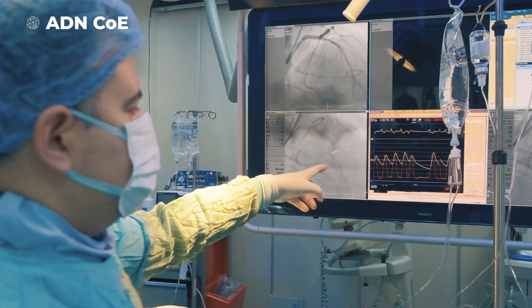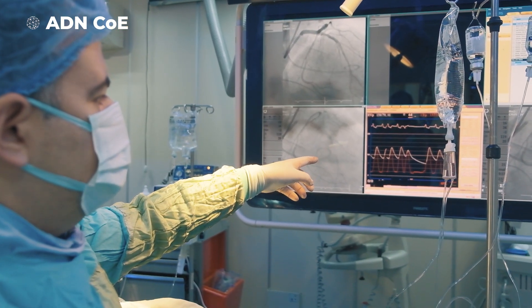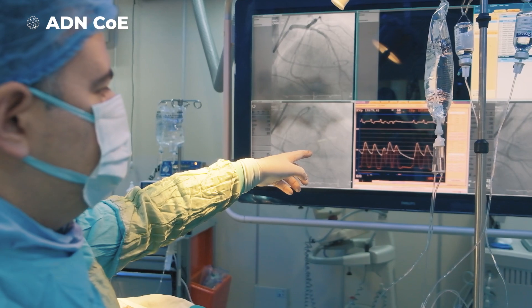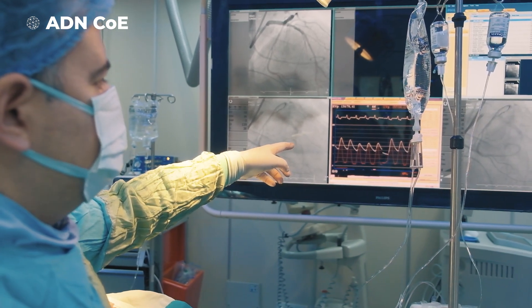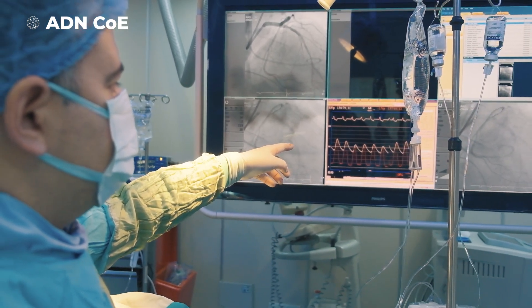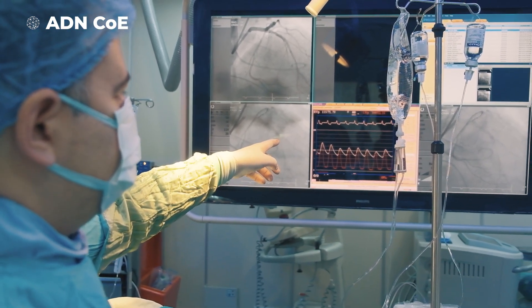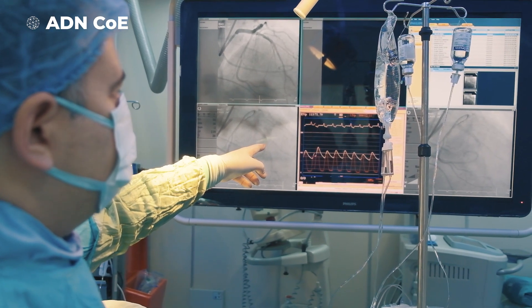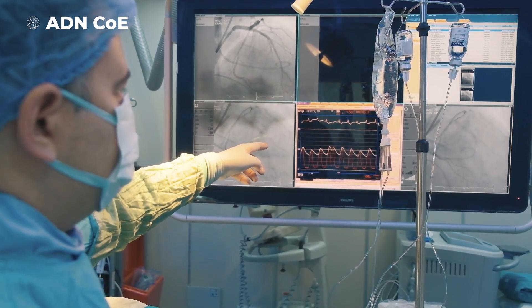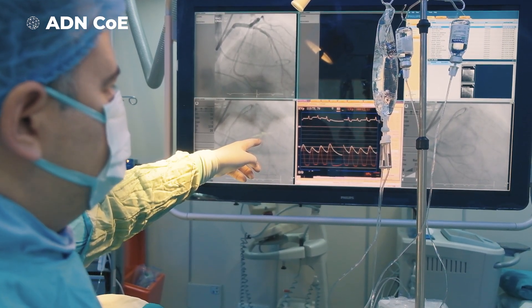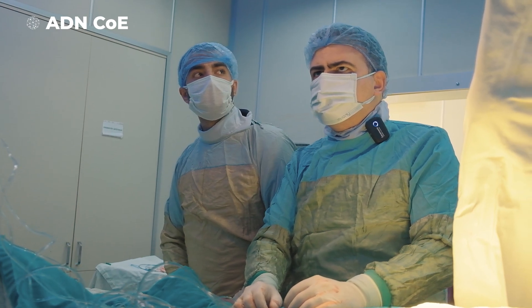At the end of the procedure, you can see that there is no peak-to-peak gradient between the outflow tract and the left ventricle. As you can see, there is a widening of the QRS complexes, so we will observe the patient in the intensive care unit.